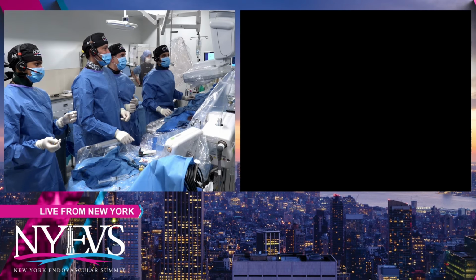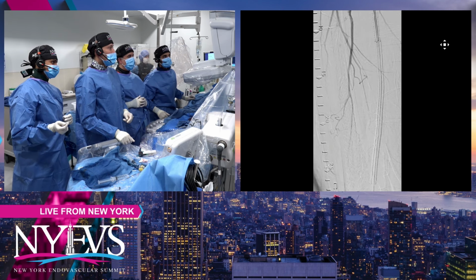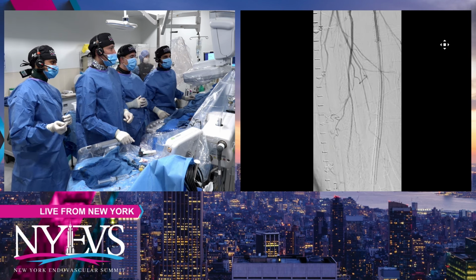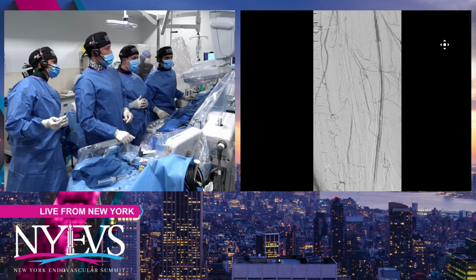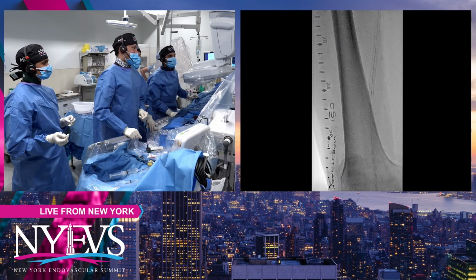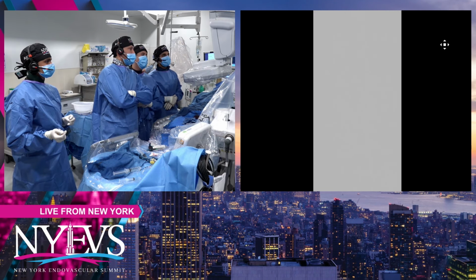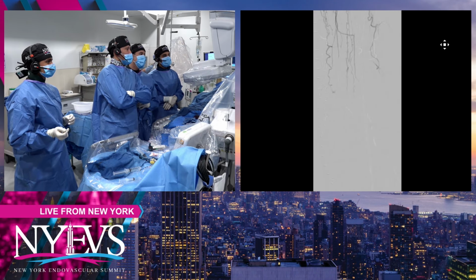Well, let's see, Dr. Zeller, your experience is definitely appreciated. Okay, it's coming. There's still something. Motion. Now is the money shot. It's not zero. You're right, not zero. It's like TIMI half flow. Exactly.